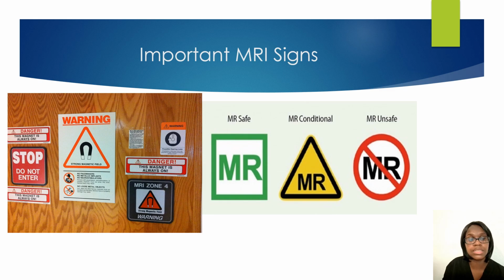The magnet is always on. Make sure that you do not have this before coming inside. So just pay attention to the signs. They're in red, so that should tell you alert or danger or pay attention to this information before you go past these doors or the sign.